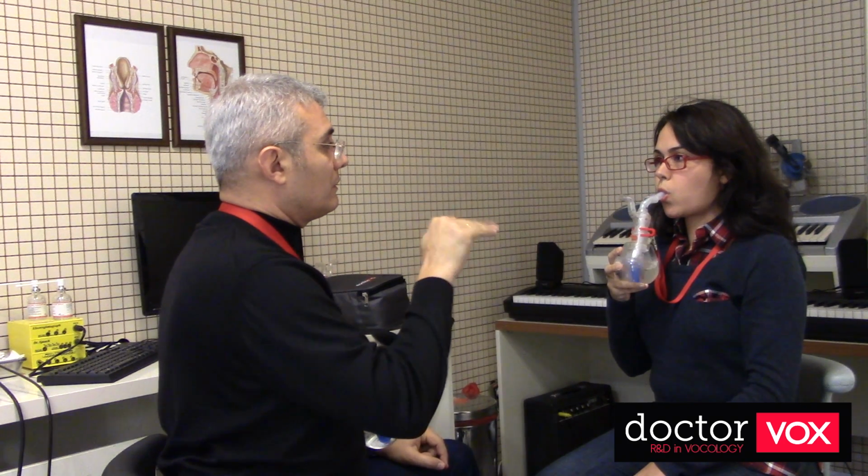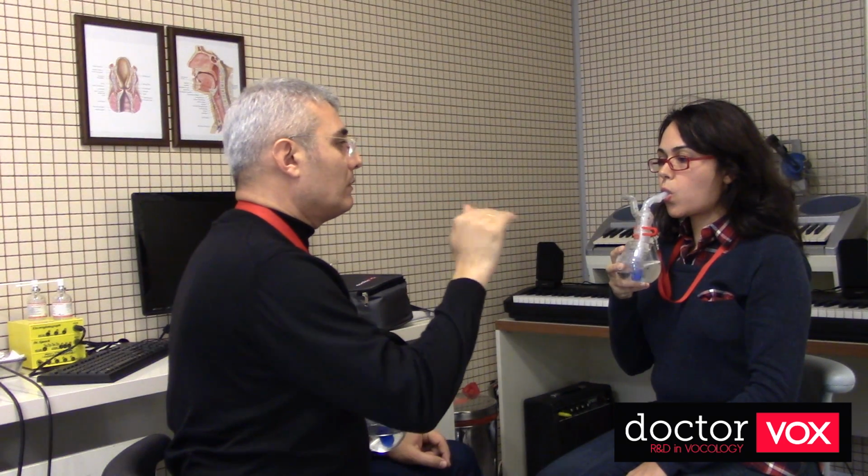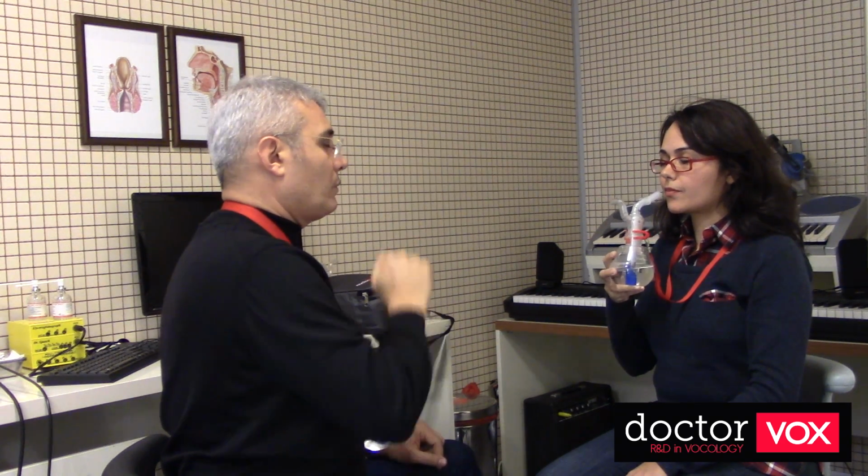In staccato exercise, the breath is paused between the tones. You can use it at the same tone, or you can use it in different tones, like ha ha ha ha ha, or ha ha ha ha ha. First at the same tone. Don't push, just try to make it stable. Ooh, ooh, ooh, ooh, ooh. Now change the pitch. Ooh, ooh, ooh, ooh, ooh.